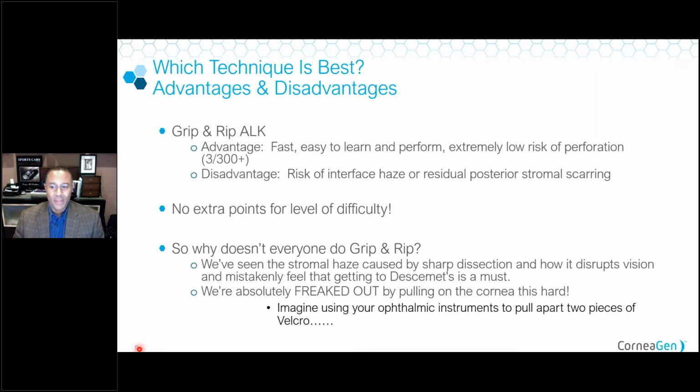First of all, the name, where did that come from? Well, I was at the Aspen Cornea Conference and we were all sharing random cases and we were all showing various videos. This was a couple years back. And I pulled out a video of one of my ALK procedures and it got a lot of attention. Later on during the conference, one of the vendors there, I think he was from Moria, said, "Hey, you're that grip and rip guy, right?" And we really didn't have a name for it. I just called it ALK because I was kind of under the assumption that a lot of people did it the same way I did it. And the grip and rip name kind of stuck, right?